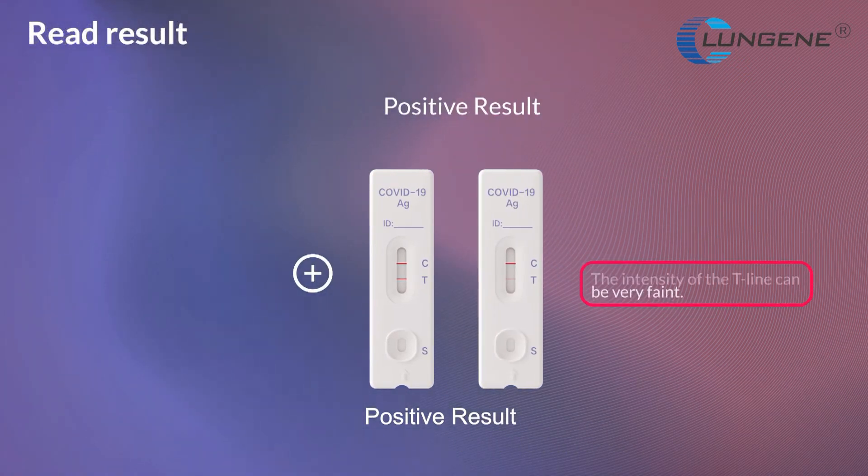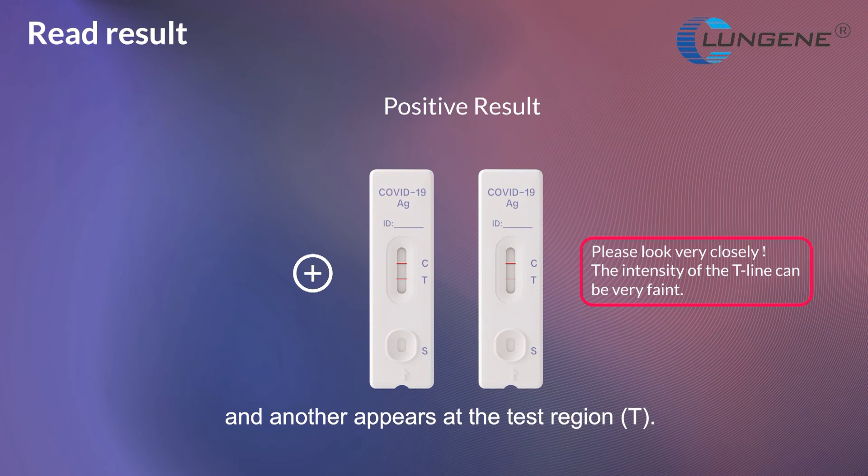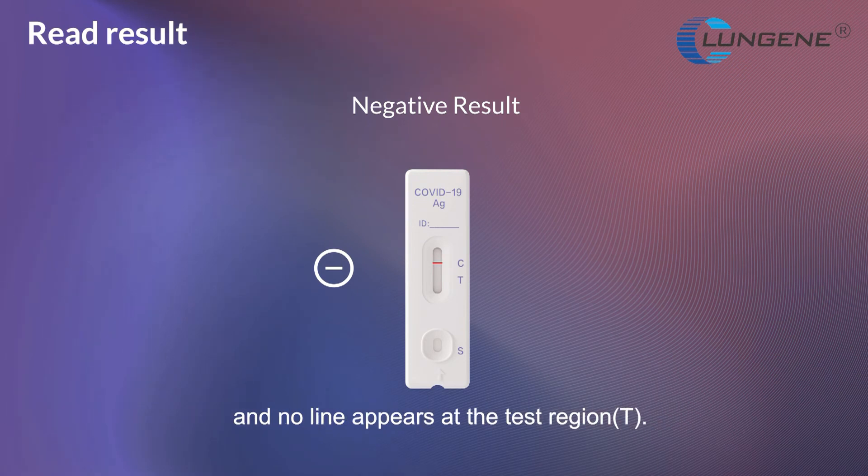Positive result: two lines appear — one colored line at the control region and another at the test region. Negative result: one colored line appears at the control region and no line appears at the test region.